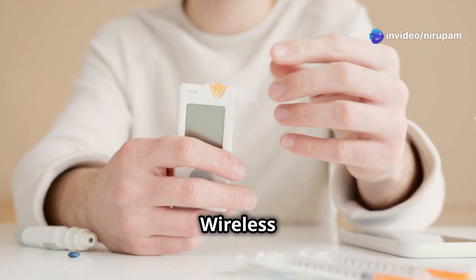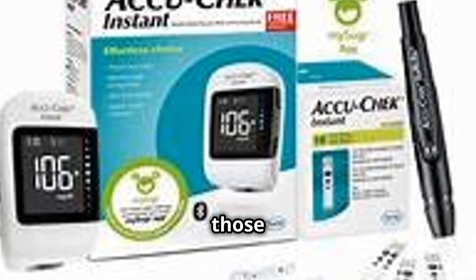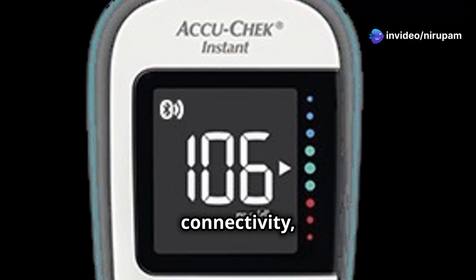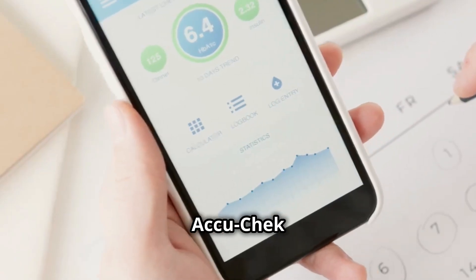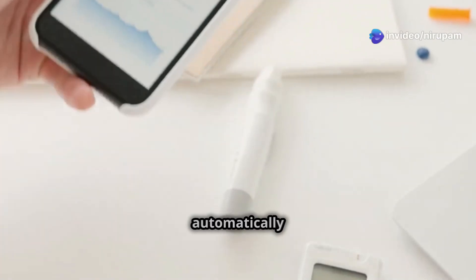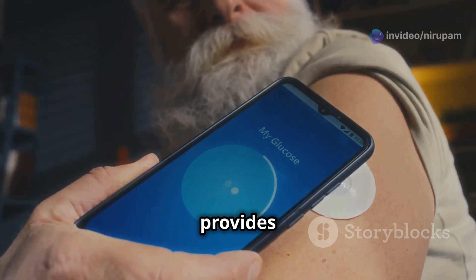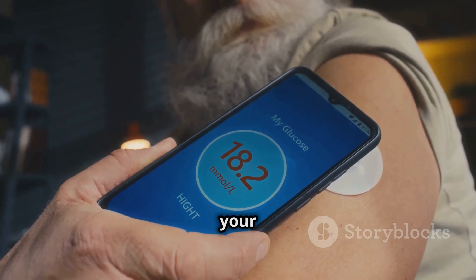AccuCheck Instant Wireless Glucometer — the tech-savvy choice. Last but not least, we have the AccuCheck Instant Wireless Glucometer, a premium choice for those who love tech-savvy solutions. This glucometer is all about convenience and connectivity, making it easier than ever to manage your blood sugar levels. The standout feature is its seamless connectivity to the MySugar app, allowing you to log your readings automatically and access them anytime, anywhere. The MySugar app also provides valuable insights into your blood sugar trends, helping you make more informed decisions about your health.